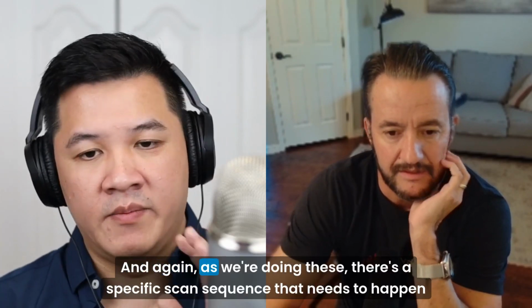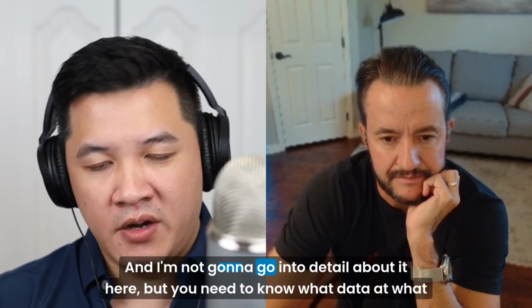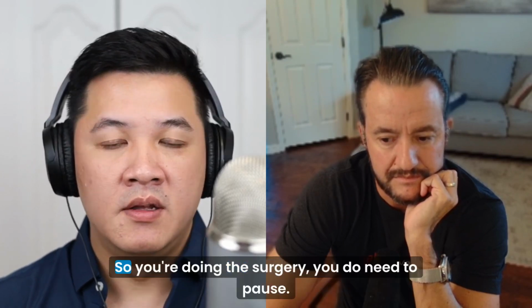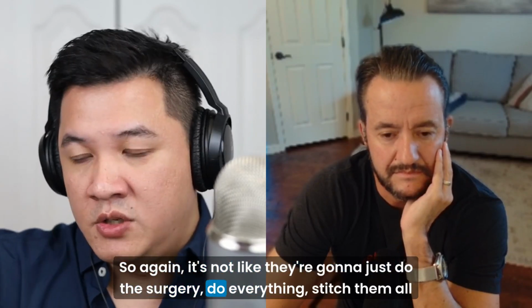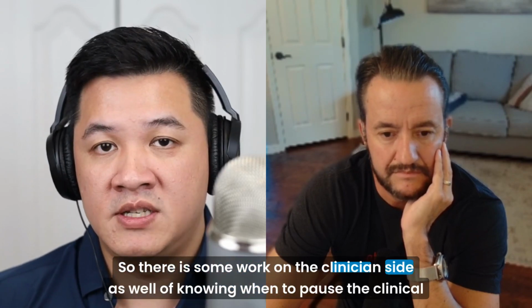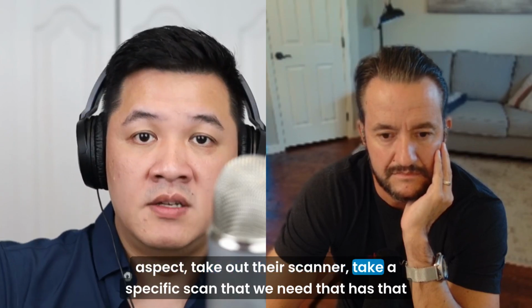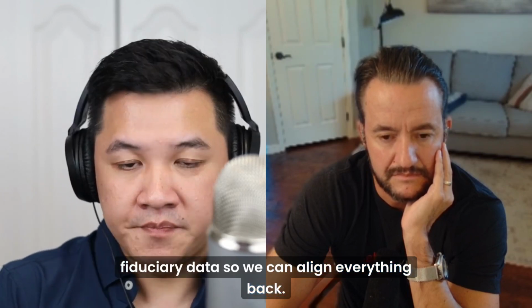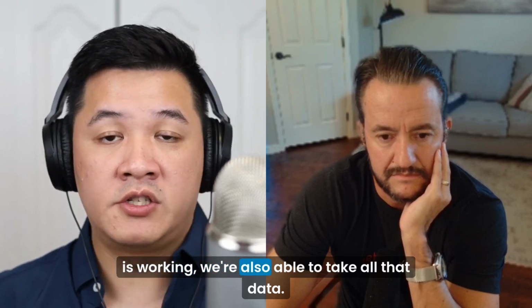And again, as we're doing these, there's a specific scan sequence that needs to happen. I'm not going to go into detail about it here, but you need to know what data at what point. So you're doing the surgery, you do need to pause. It's not like they're just going to do the surgery, do everything, stitch them all up, give us a photogrammetry scan, and they're done. There is some work on the clinician side as well of knowing when to pause the clinical aspect, take out their scanner, and take a specific scan that we need that has that fiduciary data so we can align everything back. There are specific steps so that the technician, while the clinician is working, is also able to take all that data.